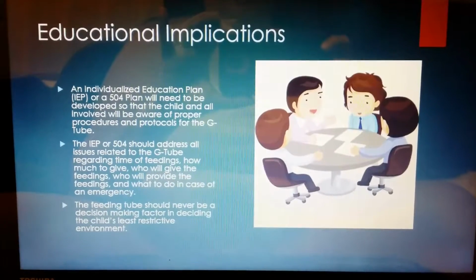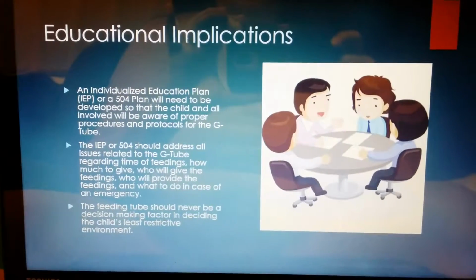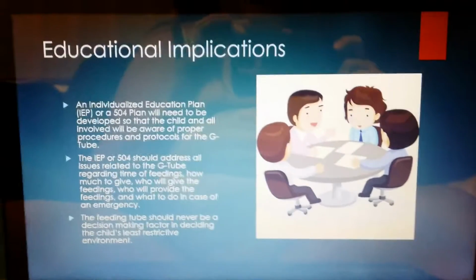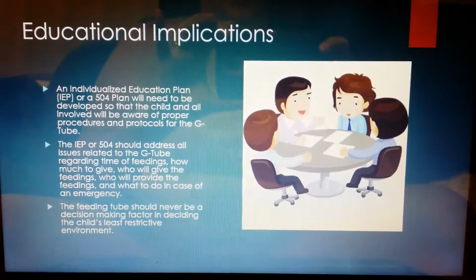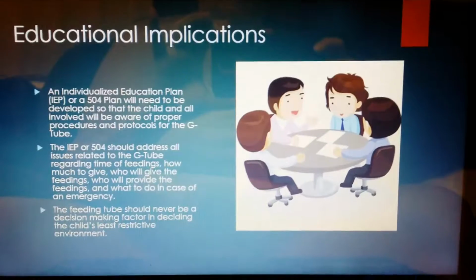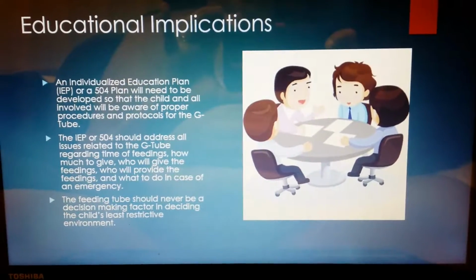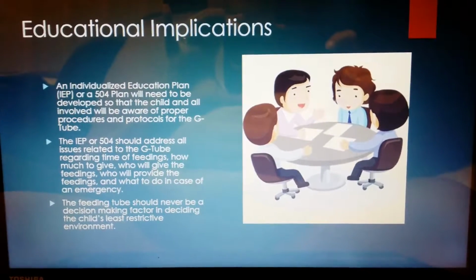an emergency. For example, I had a student in my class this past year who had a G-tube that was not being held in place by the balloon. It was deflating and kept falling out, and we had to call her mother to have her taken to the hospital to have another G-tube put in.